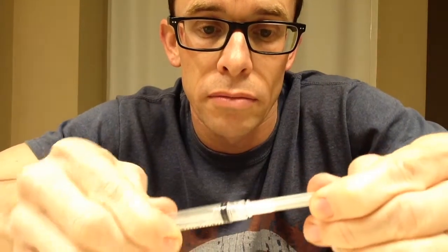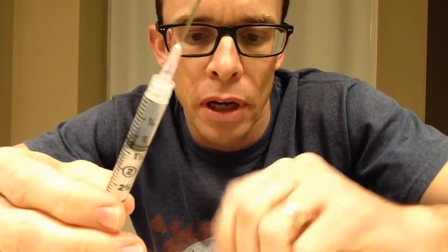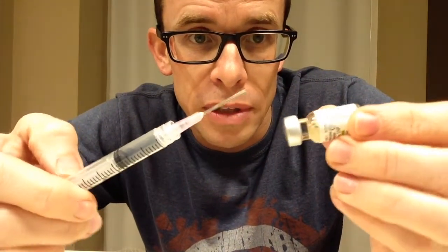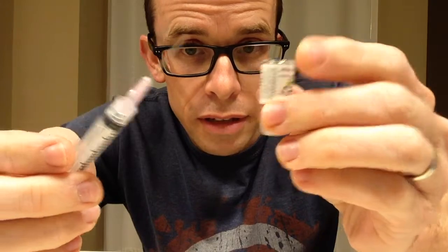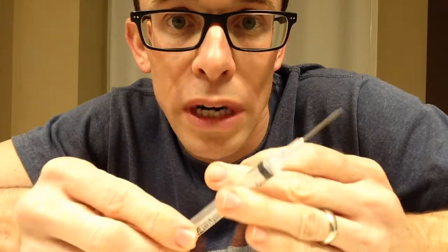Then when I take the top off, you can see that's a kind of a fat needle there. You can see the hole even in the top. Now, what you do is you actually pull this out to get a little air in there, because when you put this up in here, this is thick. It's kind of oily. And so as you put this up inside, you want to push some air up inside of that. So then as soon as you let go, there's pressure inside this at this point, and it'll naturally start to fill itself up a little more easily.